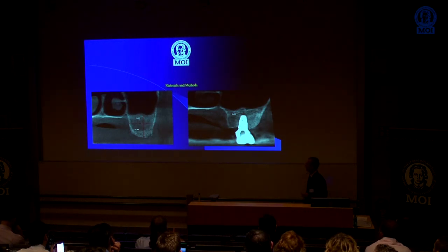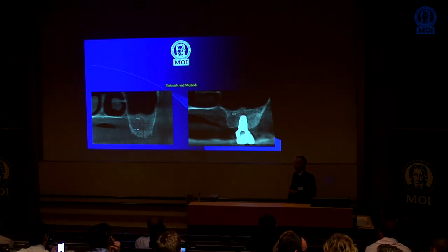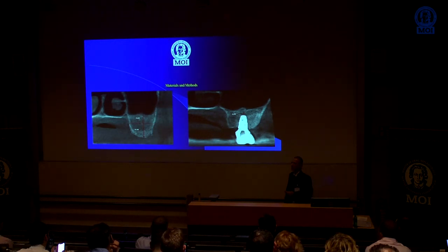After the implant had been restored and subjected to occlusal load for 1 year, the bone on the tip of the implant was measured, and it was established that at least 2 millimeters of bone should still be present, because we all know from the literature that almost two millimeters of bone should be present all around the surface of an implant in order to allow for its long-term stability under load.